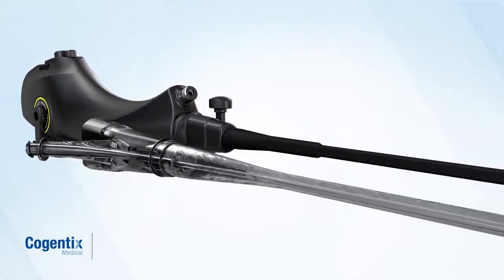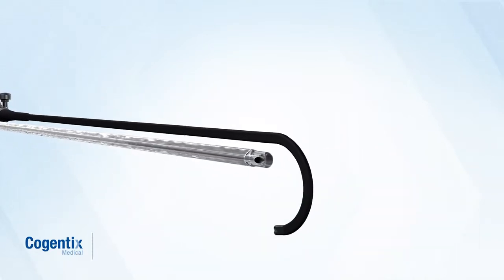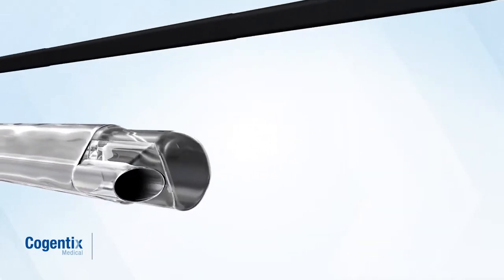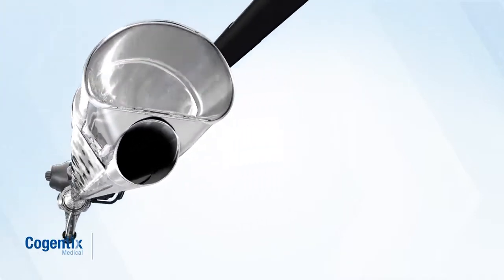Only the Endosheath system uses a sterile, single-use sheath that creates a protective barrier between the patient and the scope. This eliminates the need for cumbersome, lengthy sterilization procedures and helps ensure you have access to sterile technology when you need it.